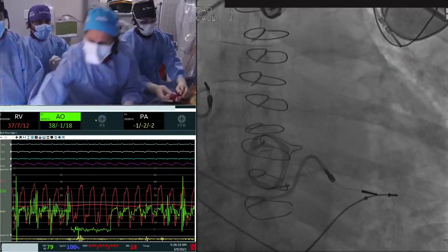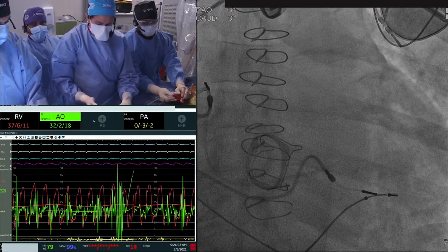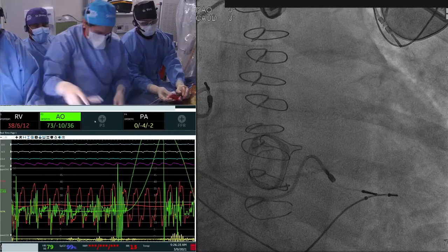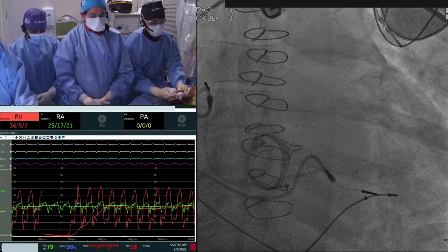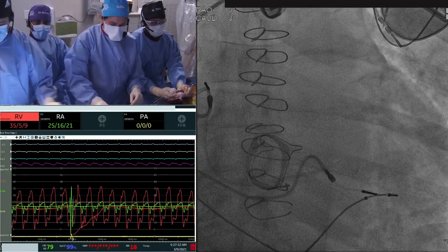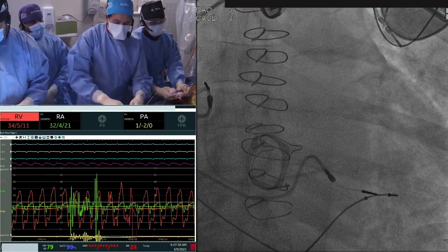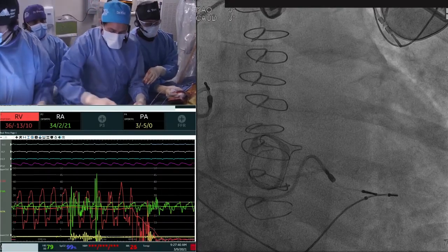Now put a little blood in the catheter so that it does not have that fling. One second, let me flush everything. Many times when you have those special catheter flings, don't put only saline, use either dye or a little blood. Our goal here is to get the Confida wire into the RV. I think what we'll do is we have a Swan first. We're going to exchange the Swan for the pigtail quickly, and then we'll go with the Confida wire.